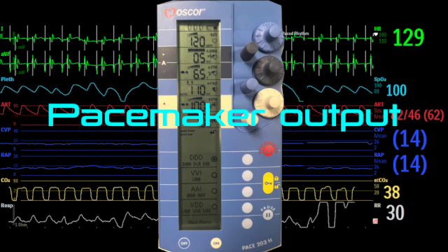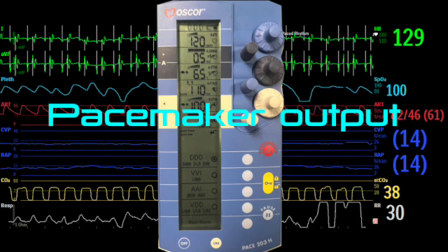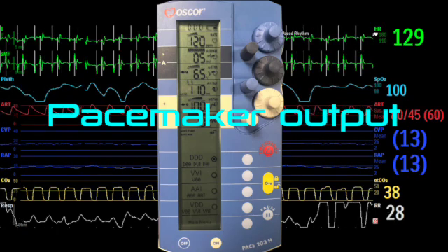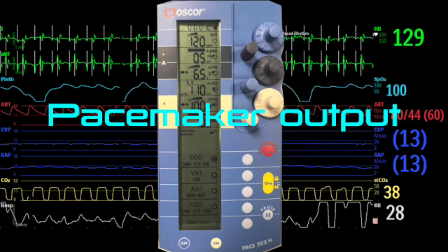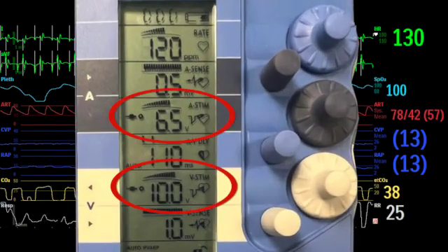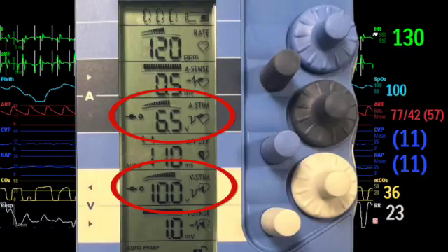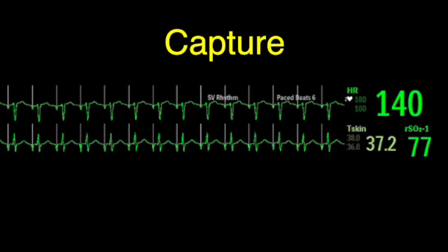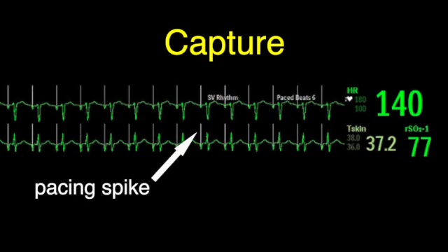After rate, pacemaker output is the second most likely setting you may need to adjust on a temporary pacemaker. It's labeled 'stim' on this pacemaker for stimulation. Output is the energy or current delivered through the wires to the myocardium, measured in milliamps.